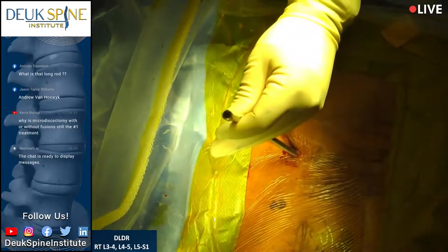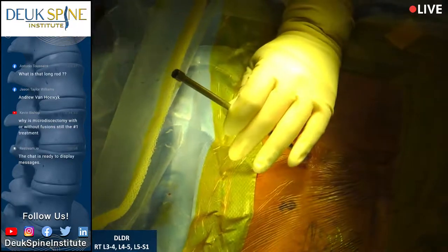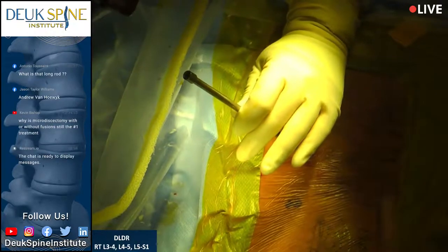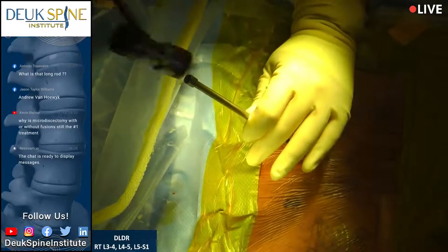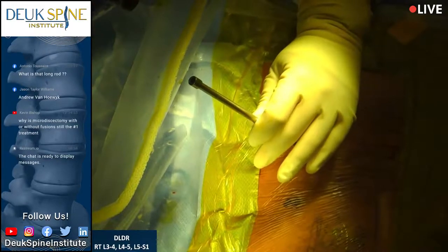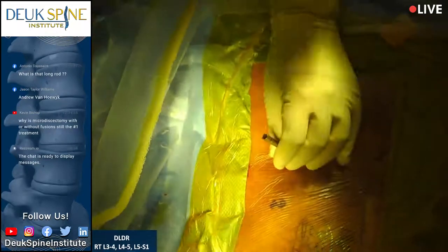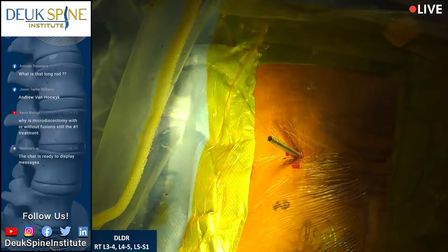Good. Shot. Sometimes the pressure is high enough, it'll literally push the instruments out of the disc. We have to stop and put them back in. There we go. All done. Shot. Let's move the fluoro out.